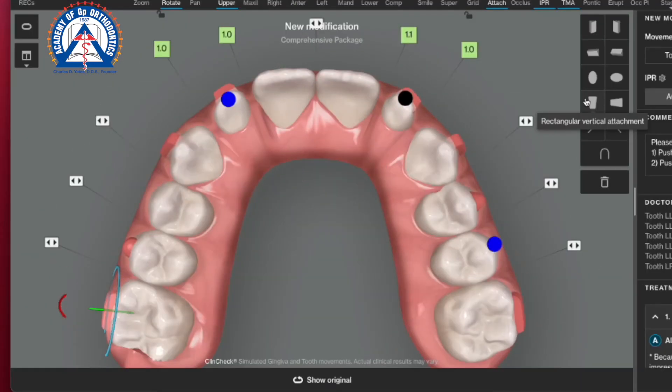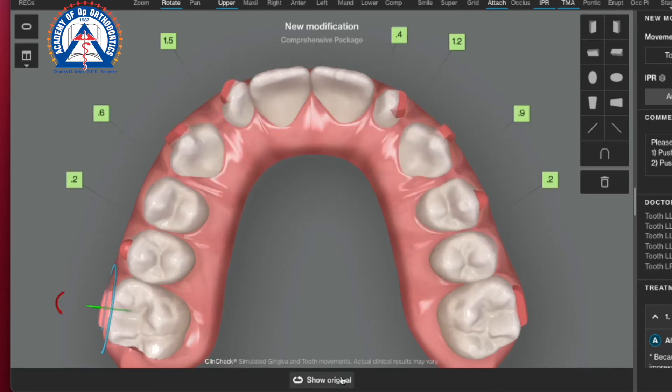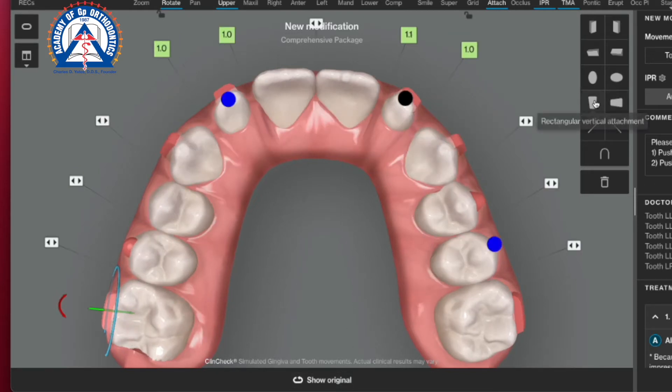Disclaimer: a smarter way to deal with peg laterals would be to build them up how you want them first and then move them with Invisalign. In this case I didn't do it for two reasons: one, I wanted to show how the attachments work without the build-up first; and the main reason is I had no room on the upper right one and couldn't get a decent accurate build-up. So I decided to move them first and build them up second.